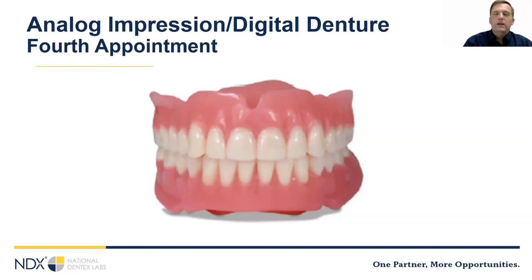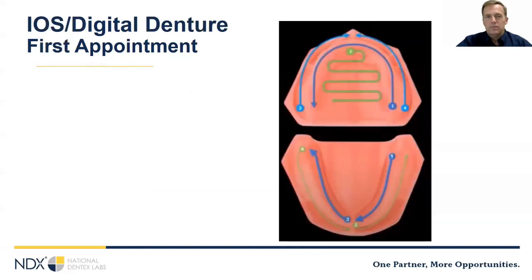Again, this appointment should be very fast for a digital denture, as opposed to, as we talked about, it can be very time consuming. And it usually won't be the beginning of a whole series of adjustments. Most people who use these find that adjustments are pretty rare. I know of one office that used to schedule a recall appointment. Now they're like, call us if you have a problem, because it's only once every blue moon that they actually have a patient who needs an adjustment.